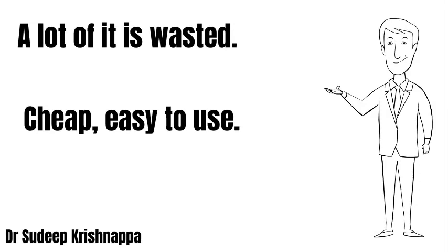As noted earlier, the functioning of this device depends on the Venturi principle and the capillary action. Because of the variations in the flow or the variations in the pressure drop, it also has an implication on the size of the aerosol generated. We know that the aerosol size needs to be less than 5 micron in order for the medicines to reach the lower airway.